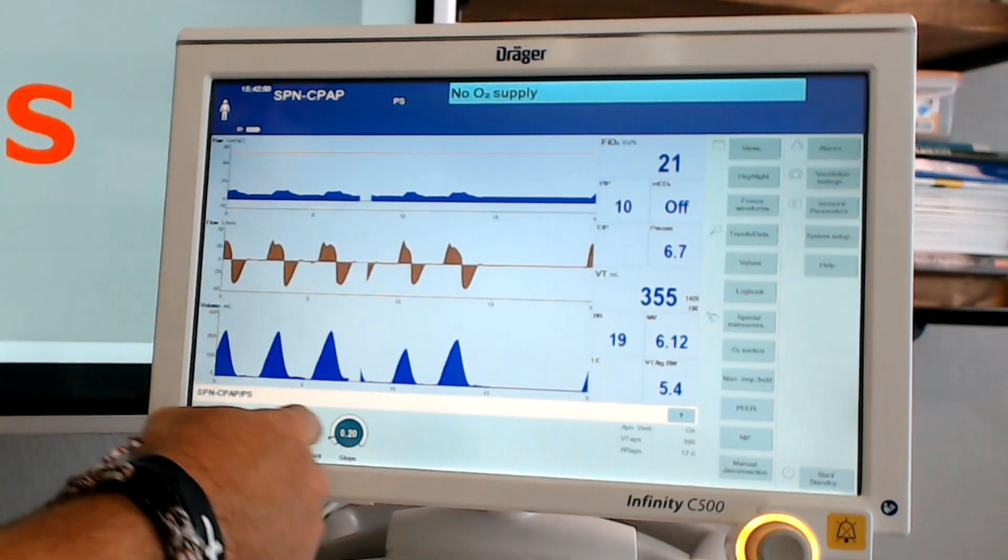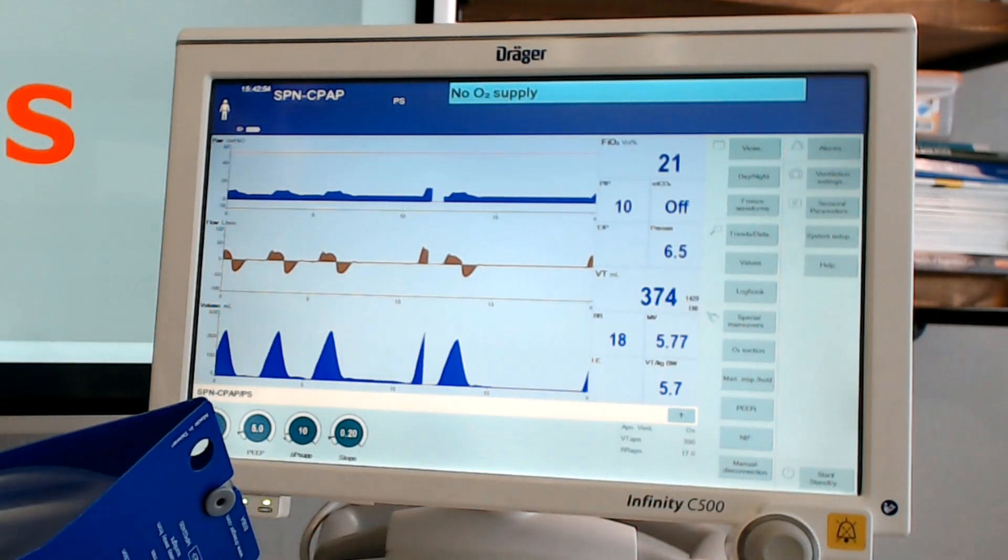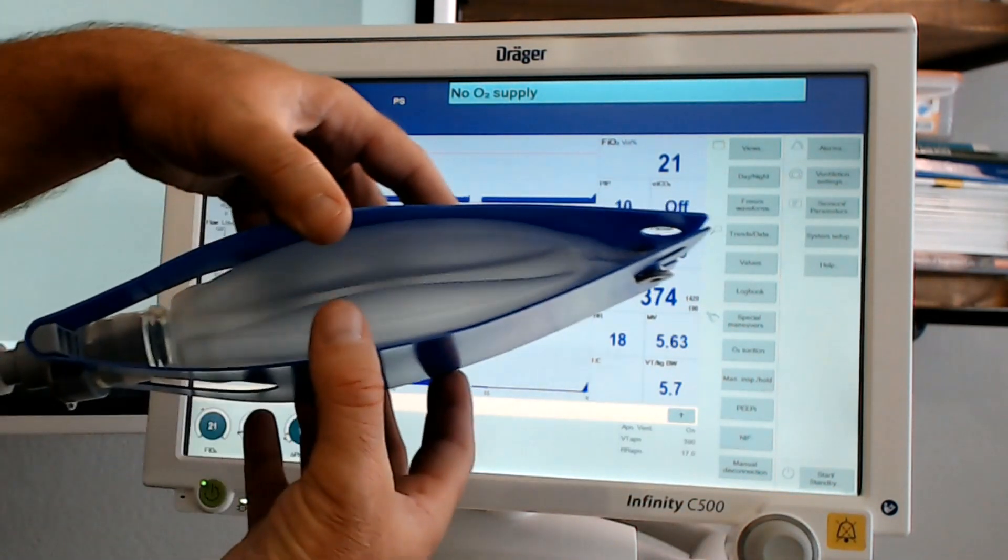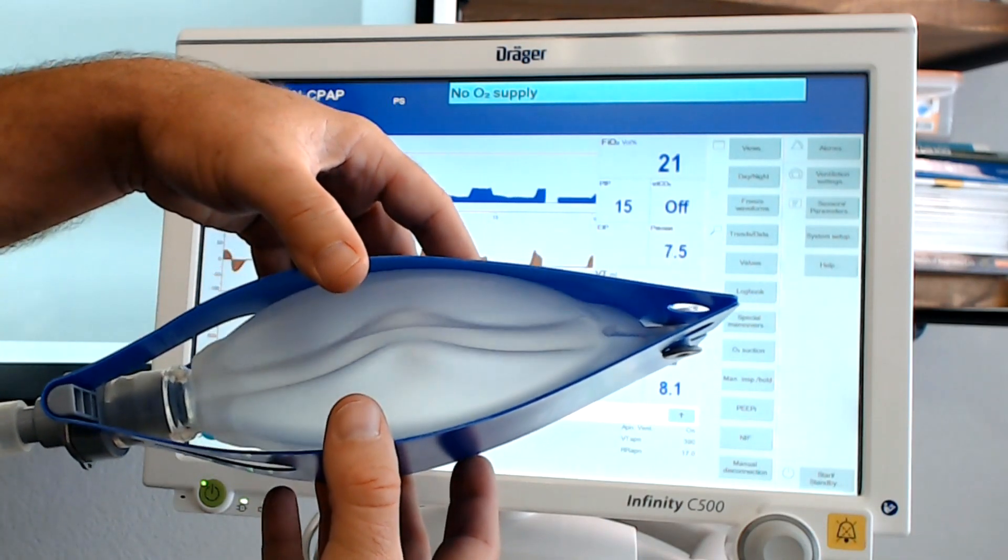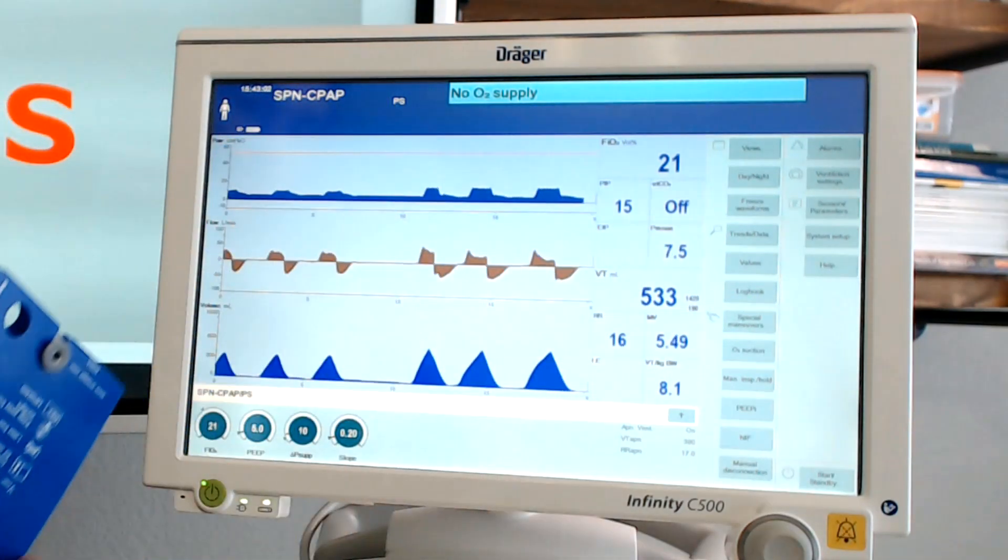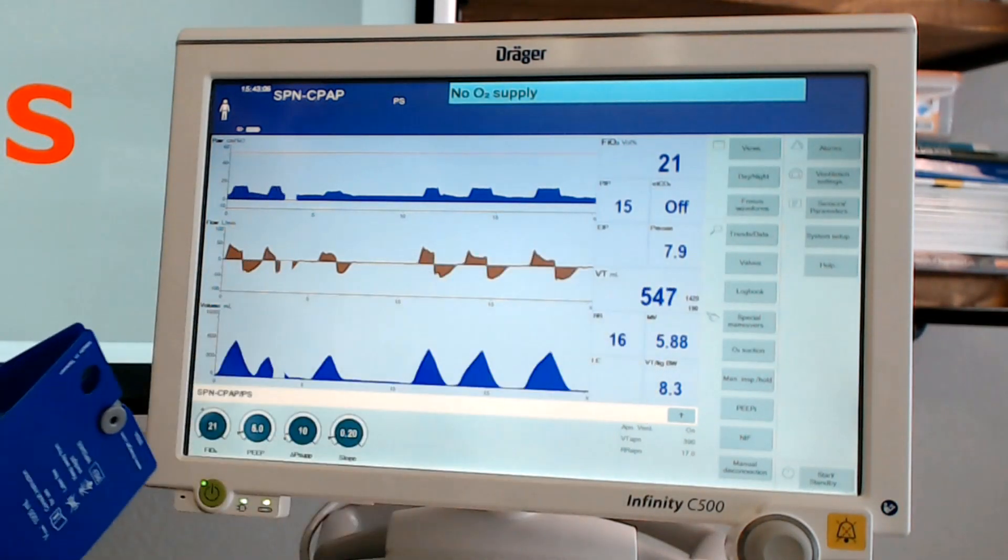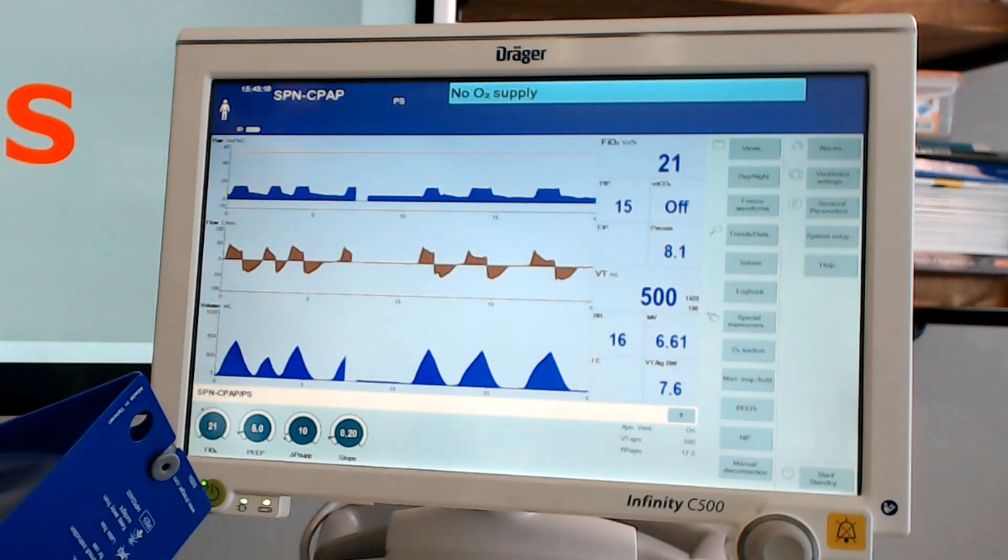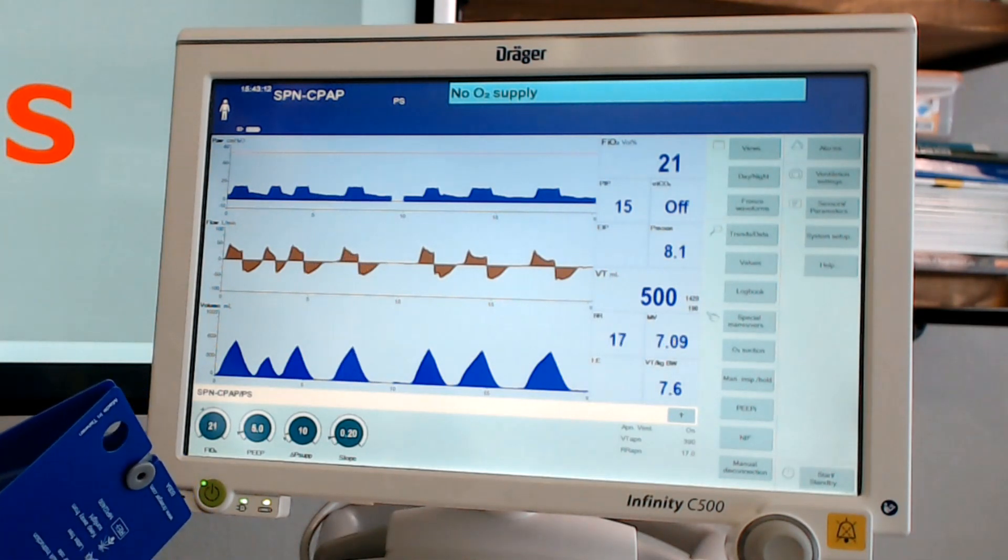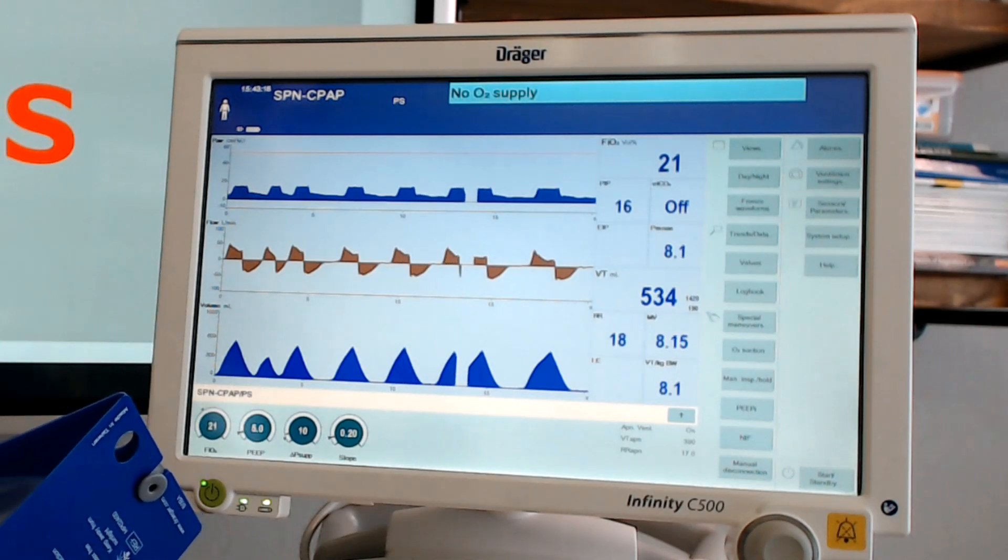Well, what if we take this pressure support to 10? Watch what happens. Same amount of pressure. Just slightly pulling on the test lung. Look at our volumes. They're now 557, 500, 520, 534.